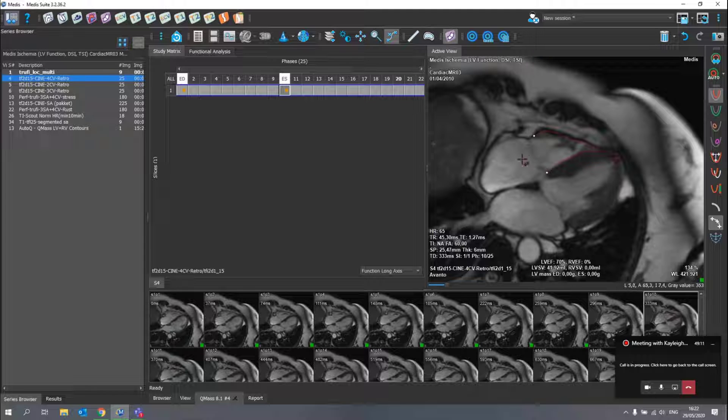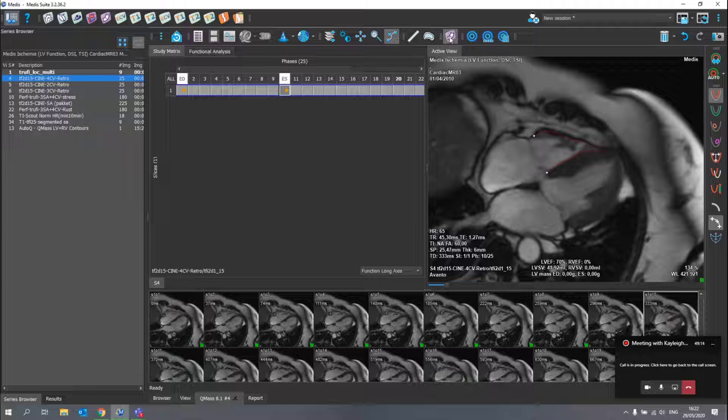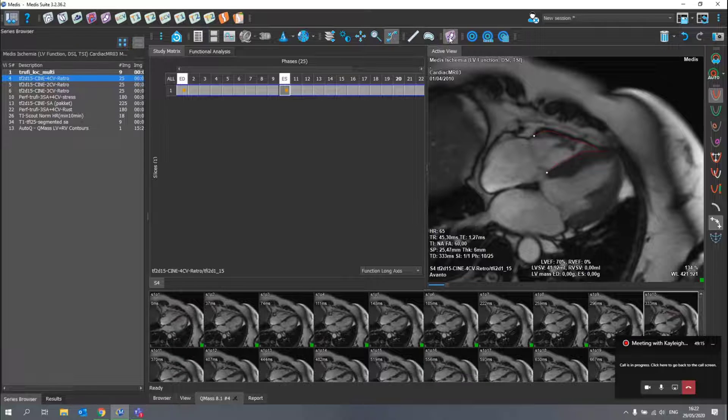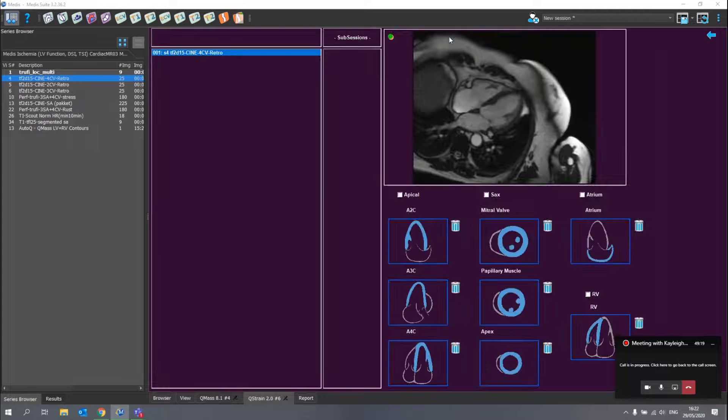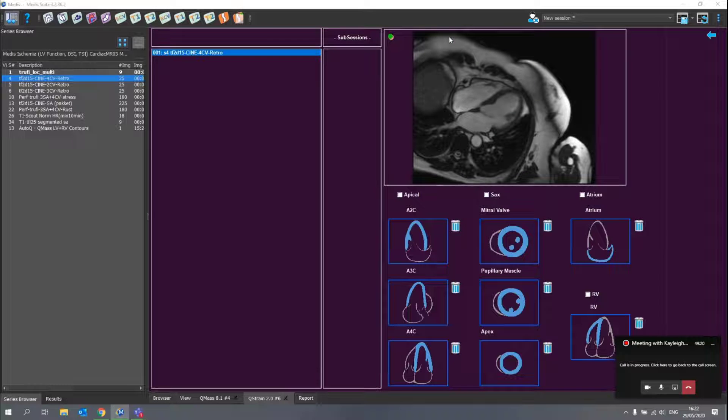Now, with the contours in place, I can simply press here on the QStrain button in the toolbar and the contours will be able to be reused here with the strain application.